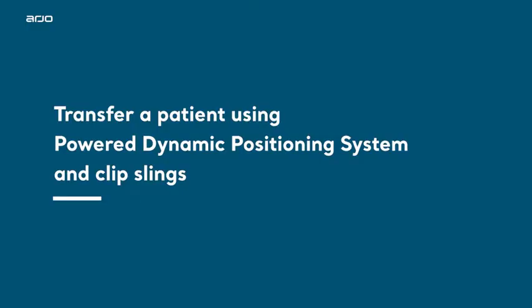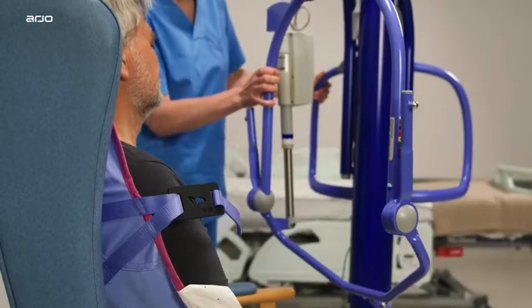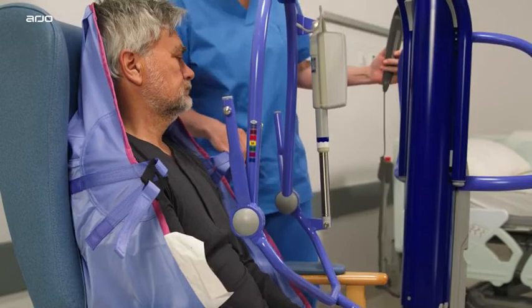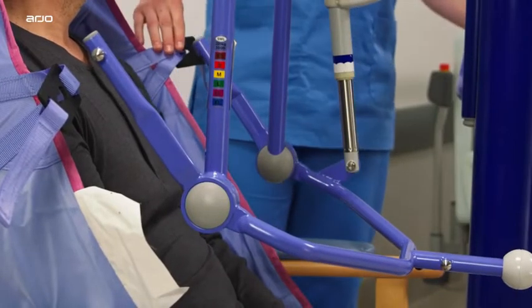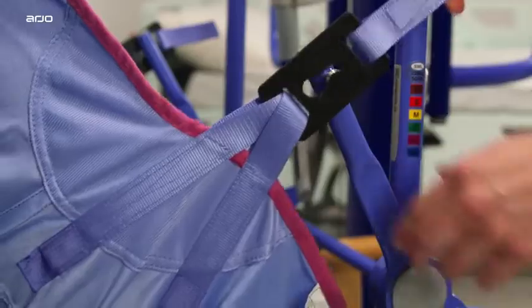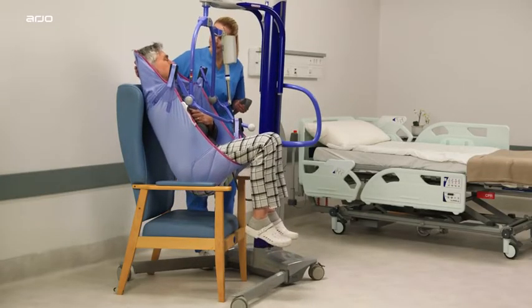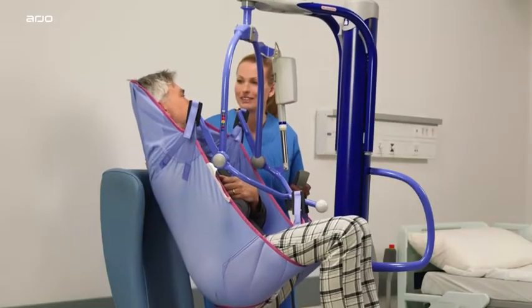To transfer a patient using PDPS: ensure the positioning handle on the spreader bar is facing away from the patient and that the open part of the spreader bar is at, or just below, your patient's shoulder level. Ensure that the MaxiMove is close enough to be able to attach the sling's shoulder clips to the spreader bar. Do not apply the chassis brakes at this stage, as the position of the patient will adjust to the centre of gravity of the lift while the patient is being raised.